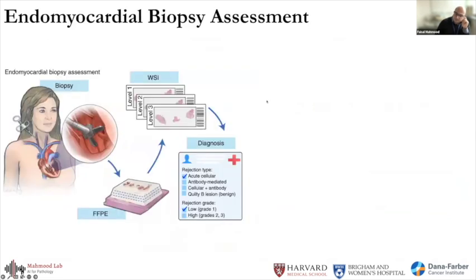So this brings us to the study that I think is more of interest to your group, which is related to endomyocardial biopsy assessment. I think no one here potentially needs an introduction to this, but if there are people here who don't know, after heart transplants, patients will often undergo repeated heart biopsies to determine if the donor heart is being rejected.